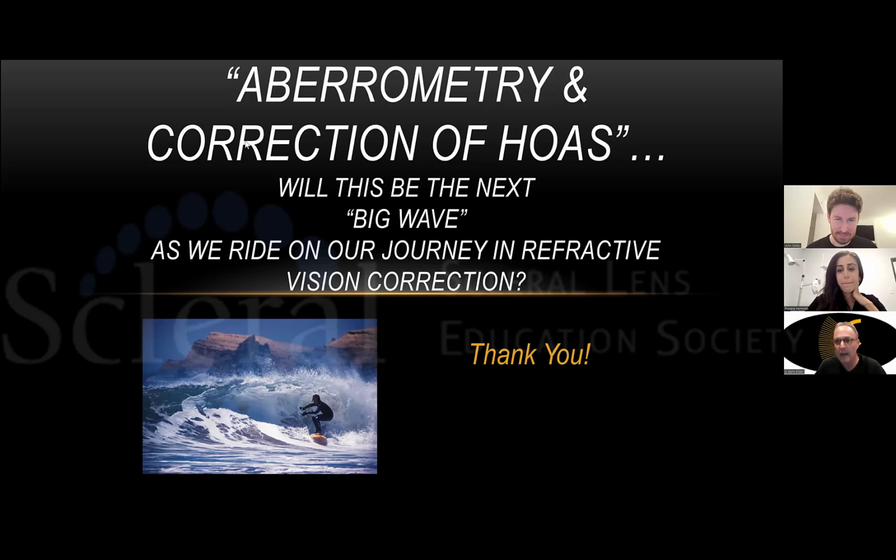Well, I'll add a little something to what you said, John and Tiff. I think one of the keys is if you have information from prior. Let's say you've run a Pentacam on a patient and their Pentacams have been absolutely stable, but their higher-order aberrations are increasing and you're seeing the cataract form. I think just by simple deduction, that's the best way. Of course, the new AXL wave system really has the ability to do that and differentiate the back of the cornea, the front of the cornea, versus the lens. So I think that's going to be very, very helpful.